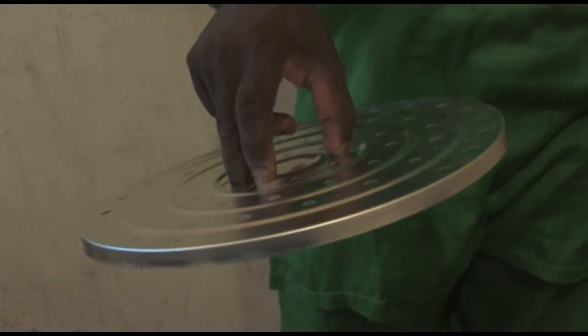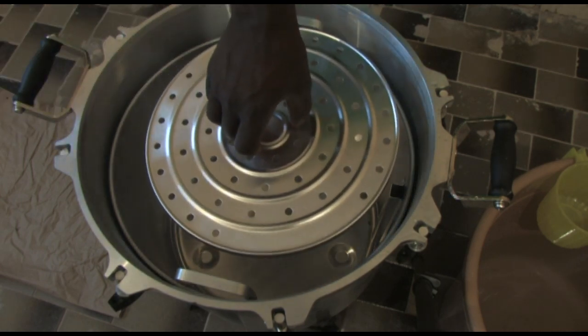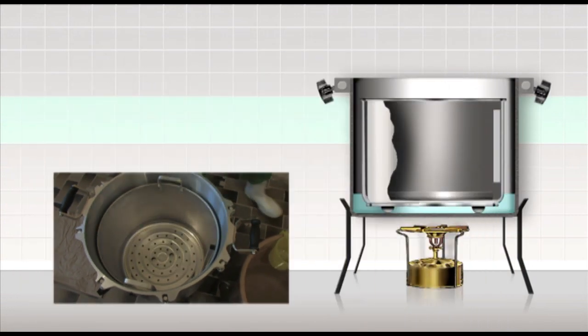Place the inner container rack in the bottom of the container with the lip or edge side facing down. The purpose of this rack is to provide a space in the bottom of the container so that air and steam can circulate freely.